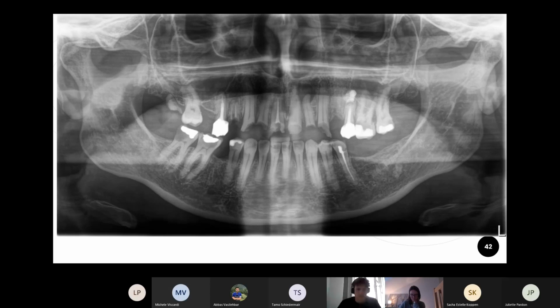All right. So what I forgot, a good example of what not to forget with the last X-ray, is, of course, saying in the beginning that it's an OPG, and saying something about the bone loss. Here, for example, we can examine both degrees of bone loss. There's horizontal bone loss among the incisors, but where the extracted teeth are in the second quadrant, you also see vertical bone loss. So I always mention that. But for the purpose of this seminar, I'm not going to start with this every time. I'm going to start immediately with what's to see on the teeth.